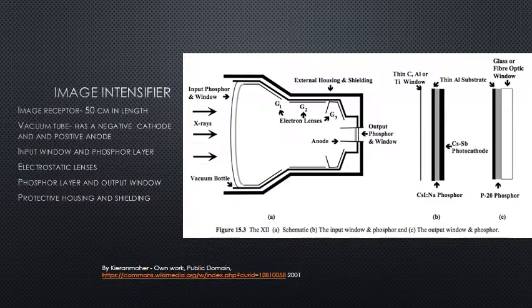So the image intensifier, as we know, was developed in 1948 to increase the brightness of the fluoroscopic dynamic image. The need to increase that brightness, as a review, was so that radiologists could use their cone or photopic vision, which was better to be used because it has better visual acuity and contrast perception.